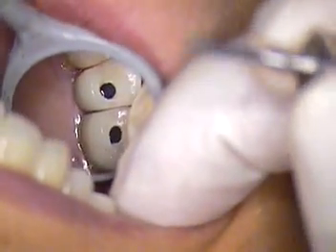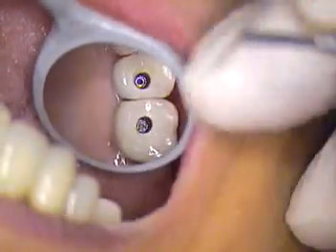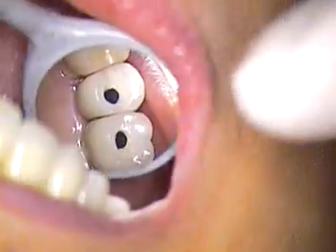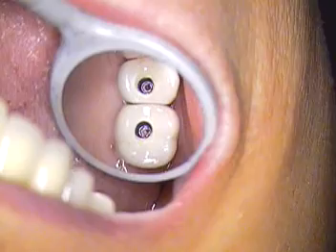Okay, right now we're going to slowly put this in, and I engaged the implant. Crown, and now we're just going to hand tighten that in. And as I hand tighten, certainly that contact's going to start to tighten up. So I'm going to get to that point, and we'll then start to check occlusion. And June, is that tender at all? Okay, she said no.